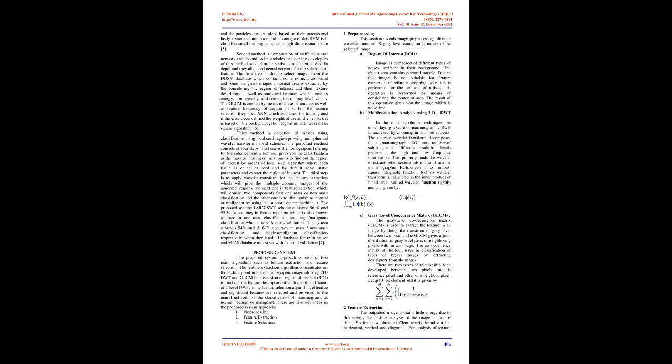The performance of GA, PSO and GSO based SVM is compared by receiver operating characteristic curve, ROC. EM method characterizes breast tissues as clusters and computes maximum likelihood, generated by a mixture of Gaussians. EM algorithm estimates missing values of clusters. Feature extraction is to reduce the original image into a set of features. These features are selected by PSO.